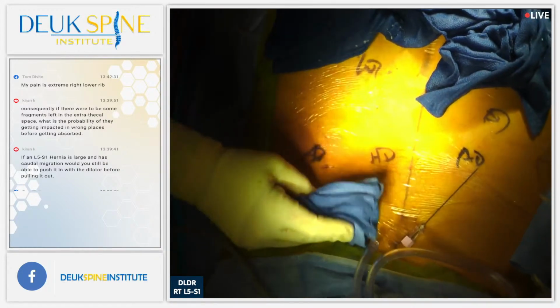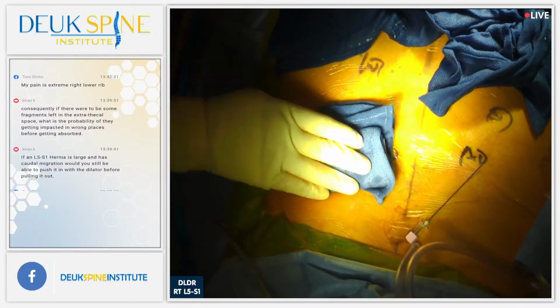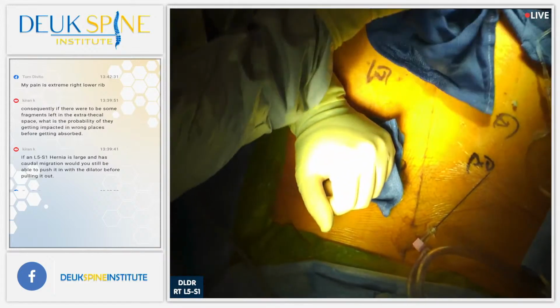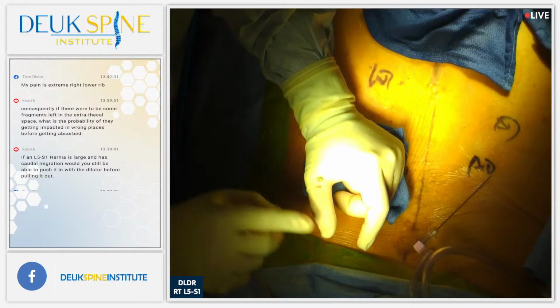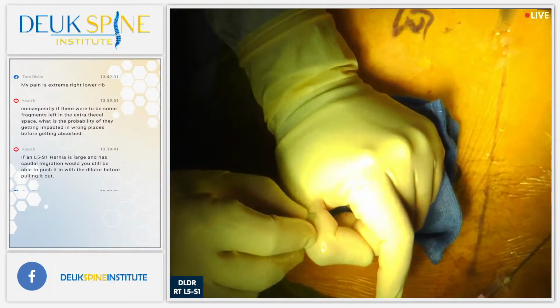And the reason that happened was, people say our laser's dangerous. They can be if you don't use them properly. Oh, look at that piece of herniation. You guys see that? Right there, Henry? Yes, we do. Here, take this for your specimen stuff.